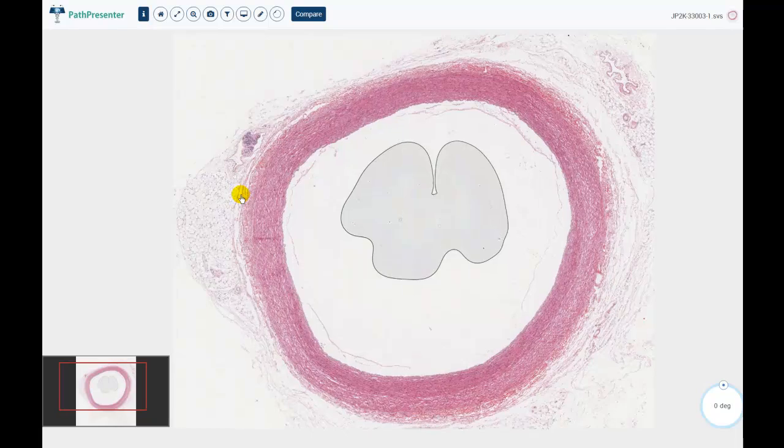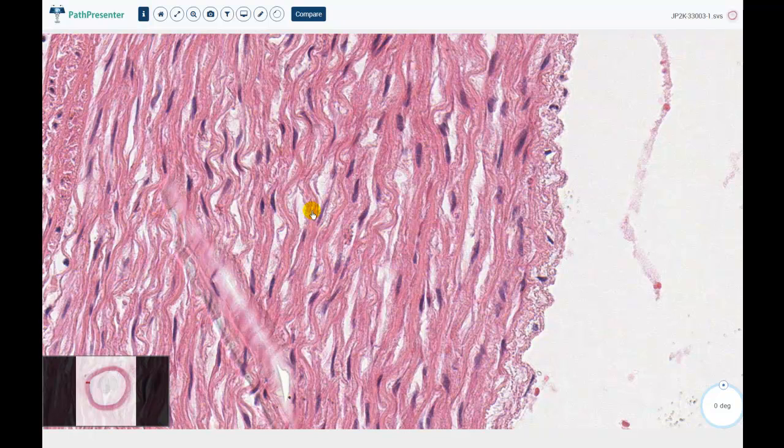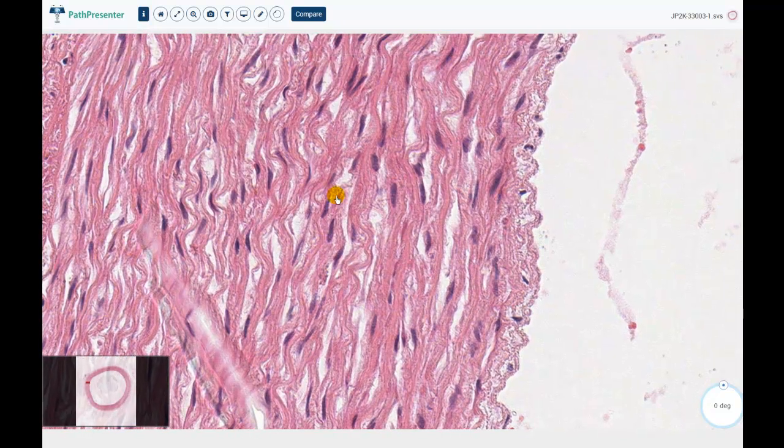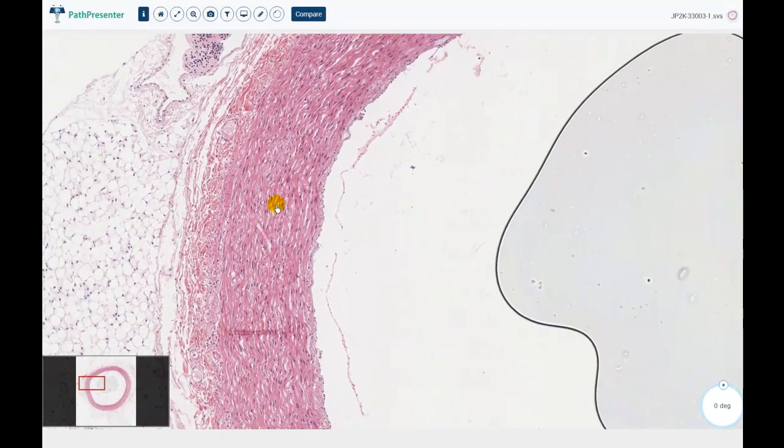if I zoom in on this specimen, you can clearly see that there are multiple layers of what looks like nuclei that belong to smooth muscle cells, and perhaps some of them belong to fibroblasts. But here I'm outlining or indicating elastic membranes. So this is a large artery. It could be a carotid artery. It could be a branch of the aorta. It could be maybe not the aorta, but similar to that.